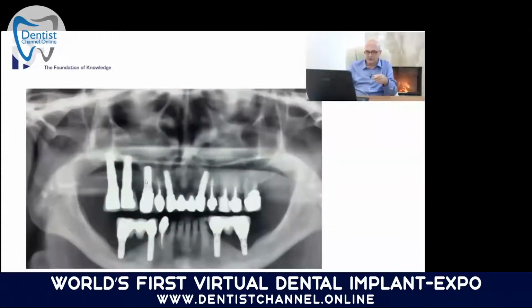Or look at this case. See the bone loss up here. The patient has pockets of more than 1 centimeter in the lower jaw also. I mean, this is not a very old implant case. It's a few years old, as far as I remember maybe 6 years old. But as you see here, a lot of bone was lost.